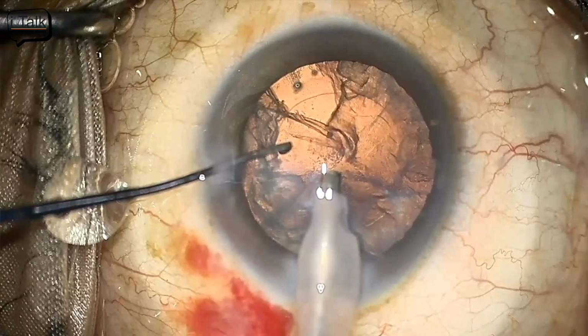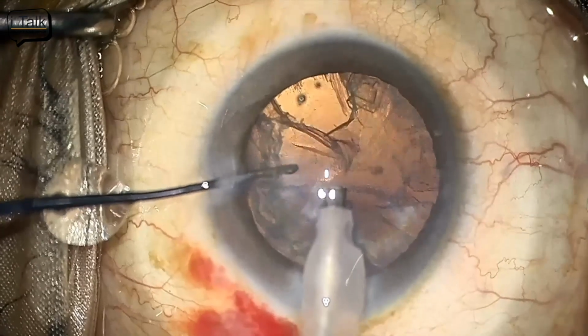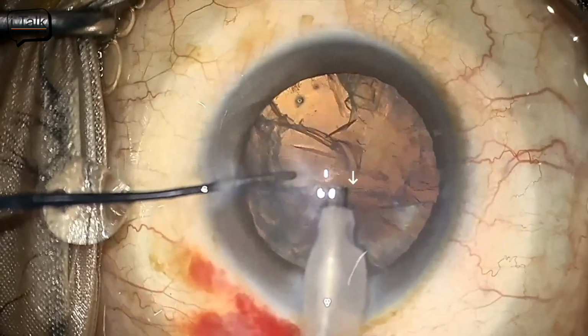So now coming to the posterior capsule. We have been talking about the anterior capsule split if there is a rhexis split, but the posterior capsule is, I think, more important than the anterior capsule, because if there is a loss of integrity in the posterior capsule, then giving an IOL in the back, how to proceed with the surgery, is more challenging in some cases. We can see that there is a posterior capsule rent. This is the video that I was showing. Let us see what the surgeon is doing.